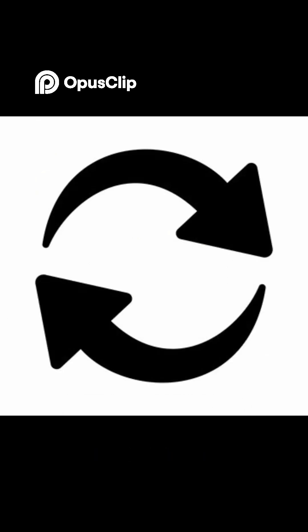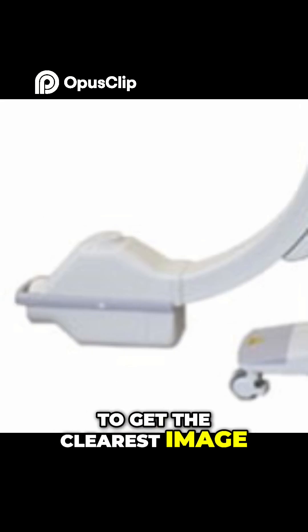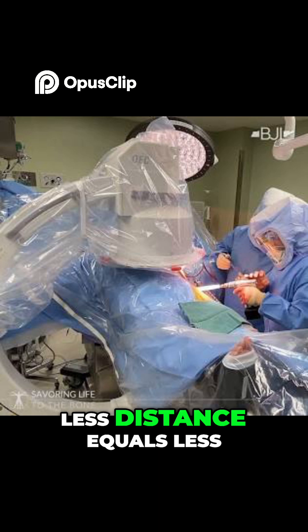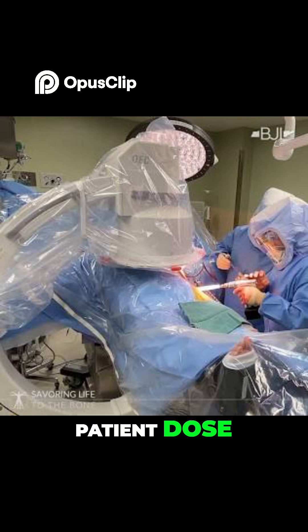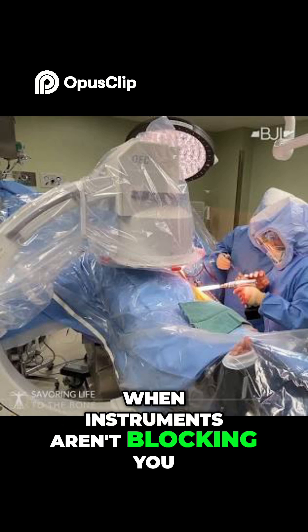Tip 1: Reverse your school knowledge. First rule, flip what you learned — the tube is on bottom. To get the clearest image, lower the C-arm so the image receptor is as close to the patient as possible. Less distance equals less blurry magnification, better detail, and lower patient dose. Save this move for the best final images when instruments aren't blocking you.